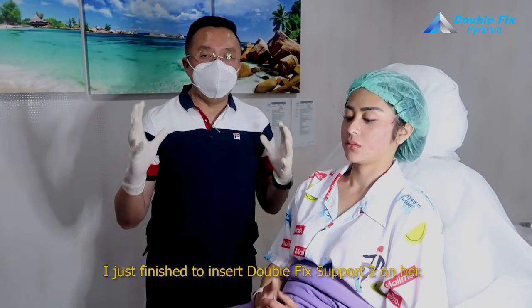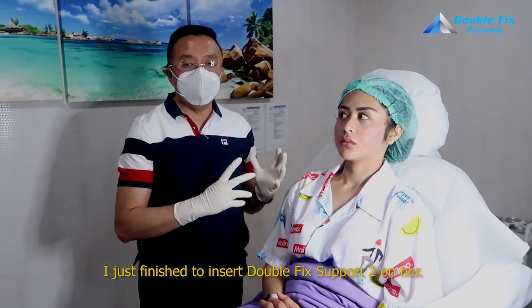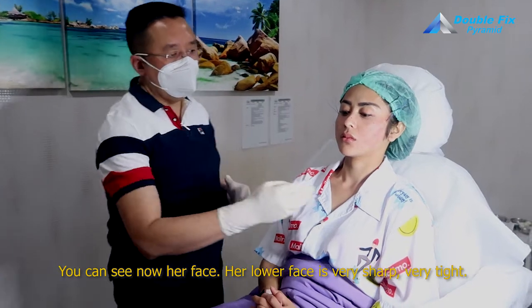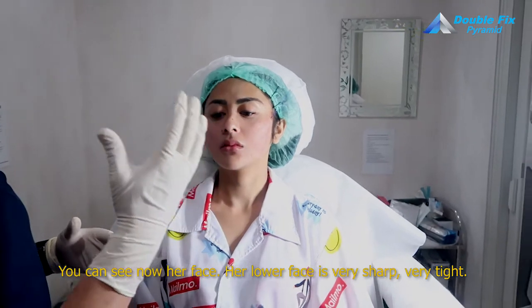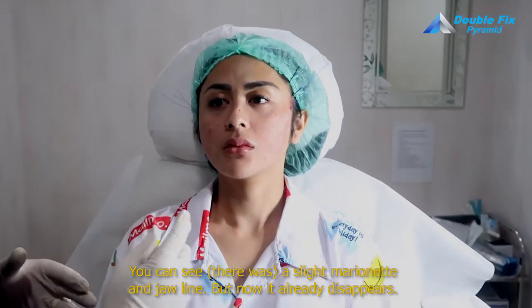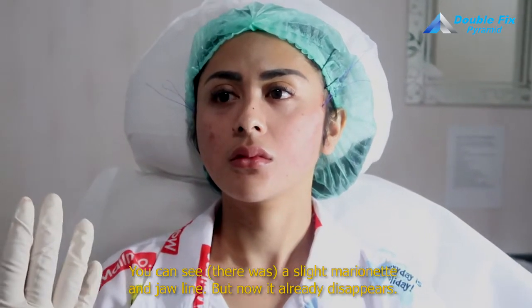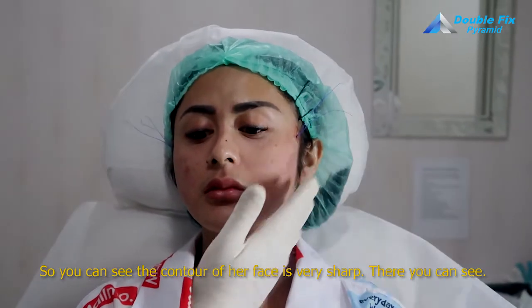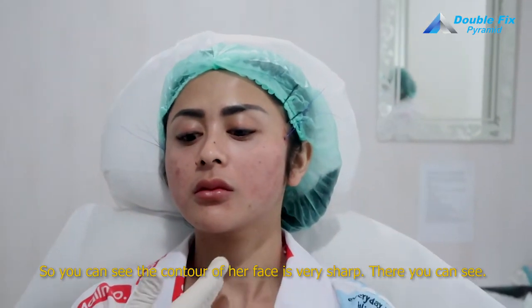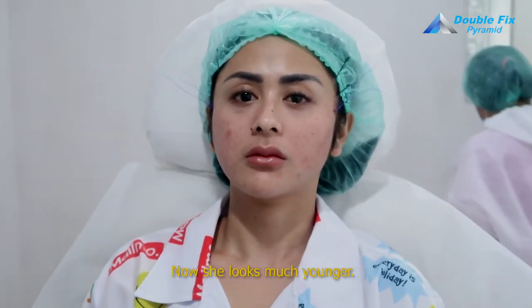I just finished inserting Double Fix Support on her. You can see now her lower face is very sharp, very lifted. There was a slight marionette line and jawline issue, but now it has already disappeared. You can see the contour of her face is very sharp — looks some years younger.